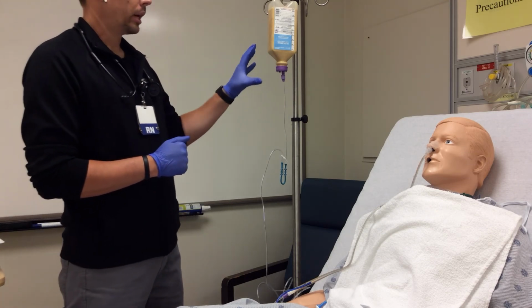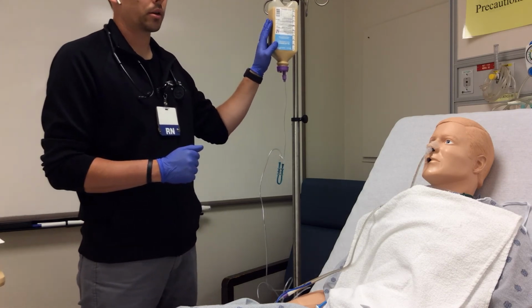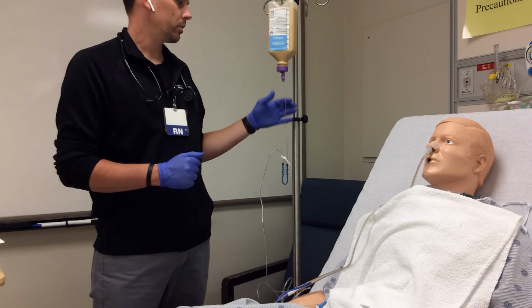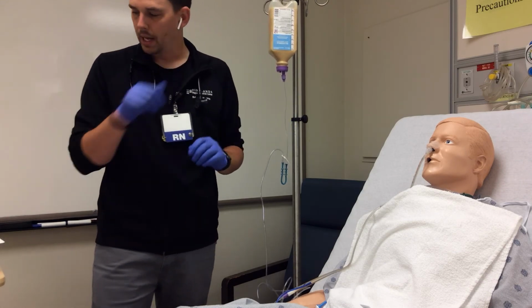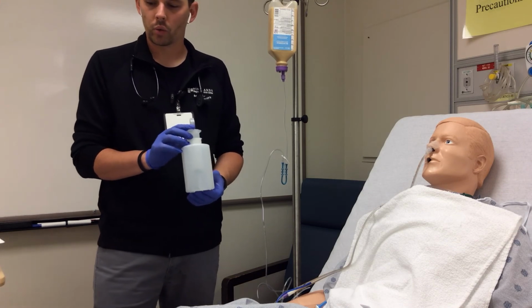We want to make sure we're marking our supplies, again, noting the date, time, and initials of when we spiked our bottle here, initial our tubing, and then we also want to make sure that we label our equipment as well, which is good for 24 hours.